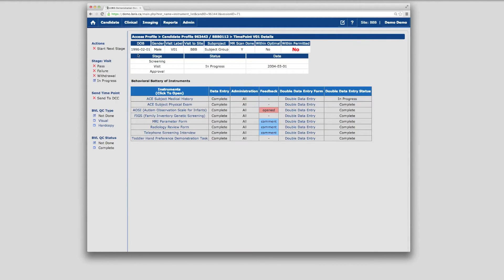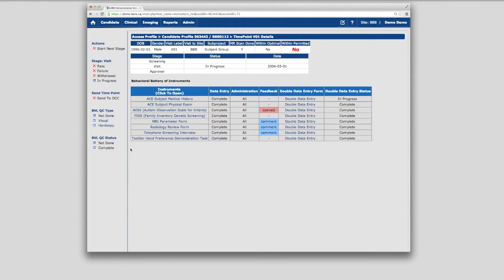Demographic information and other metadata is displayed at the top of the page, and tracks the flow of subject data through the study stages from screening to visit to approval. There are flags in the left-hand column used to indicate time point status and quality control steps applied to this time point.